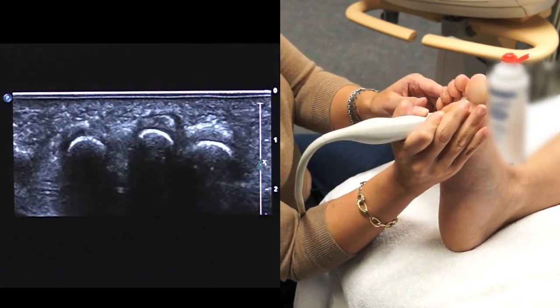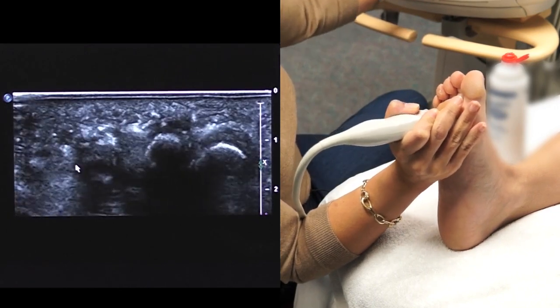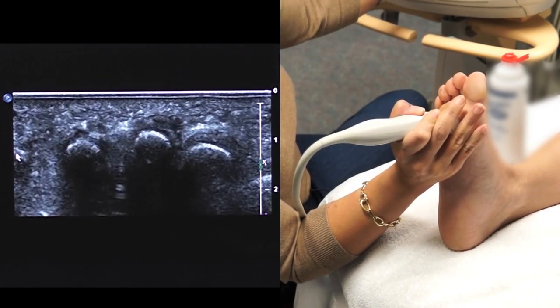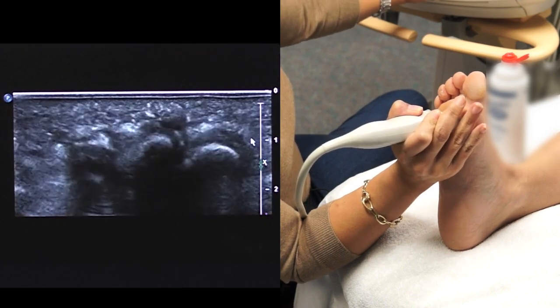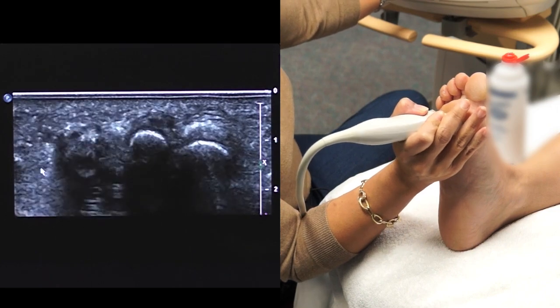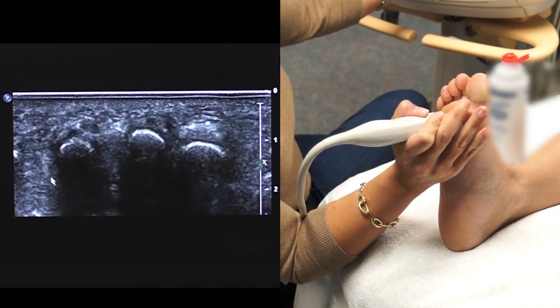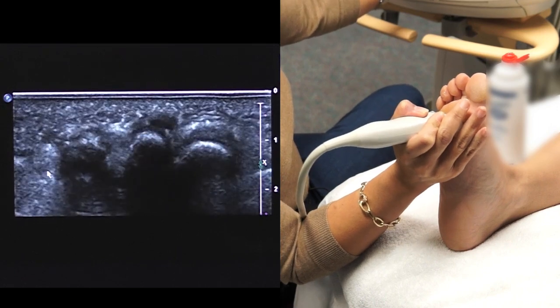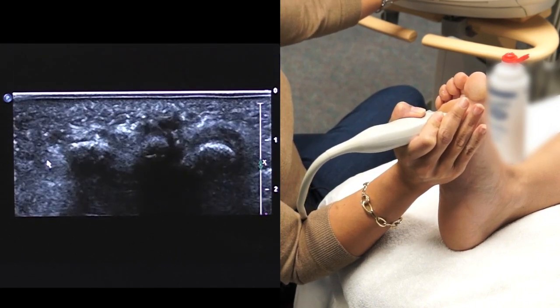Okay, so here I've got that showing in view here. This is the 5th metatarsal head, 4th, 3rd, 2nd, and we don't have the 1st in view. Now we're looking at the intermetatarsal spaces, and what you're looking for is some nice clear fat. Morton's neuroma would show as a well-defined hypoechoic structure occupying the space.